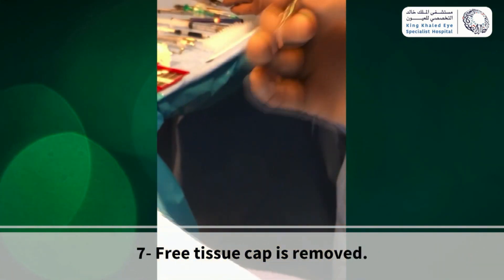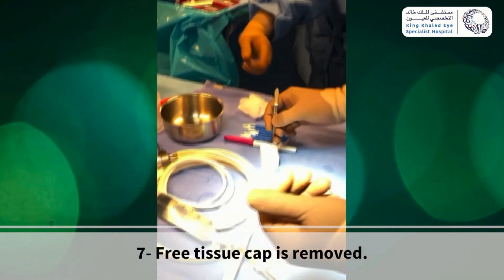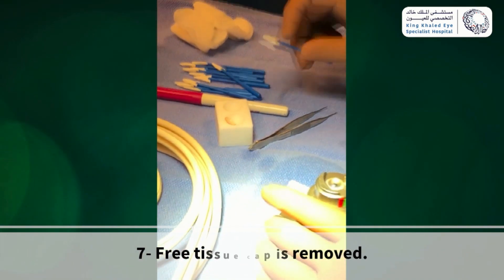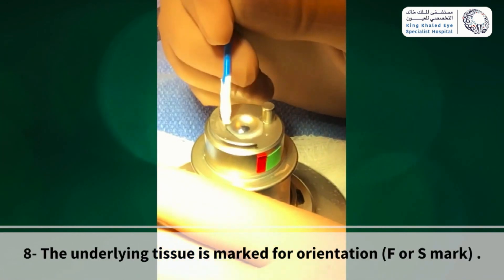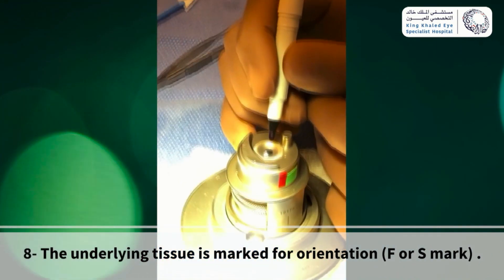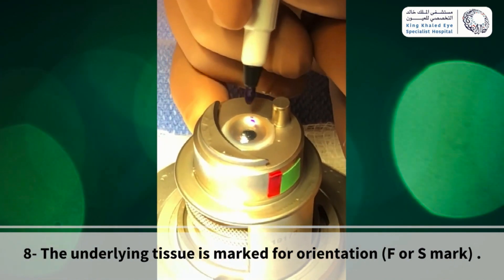Then the free tissue cap is removed. After that, the underlying tissue is marked for orientation. Use an F or S mark, whatever is suitable.